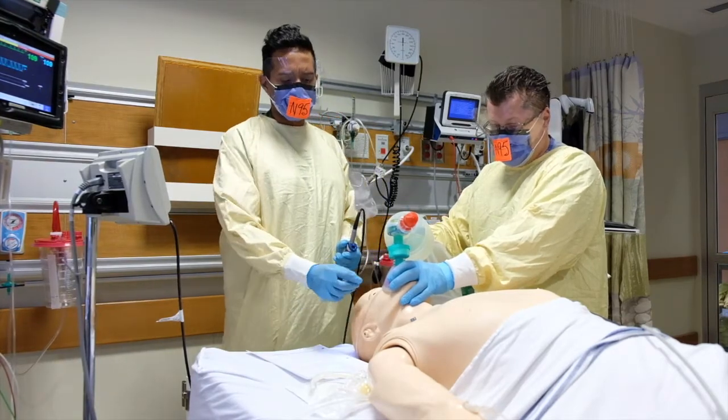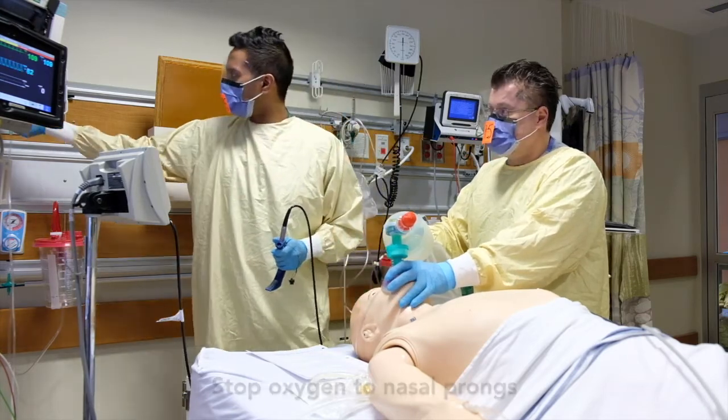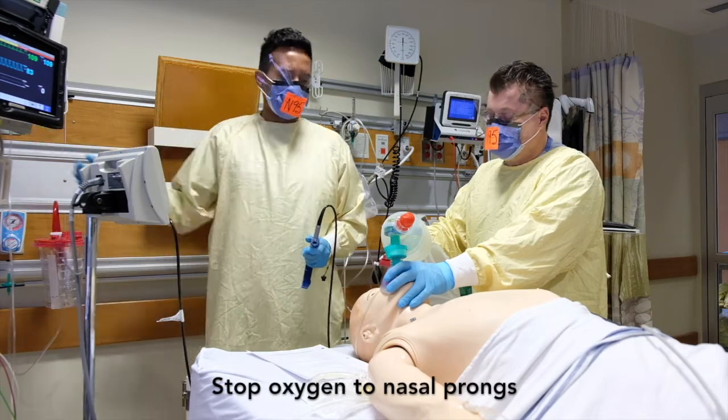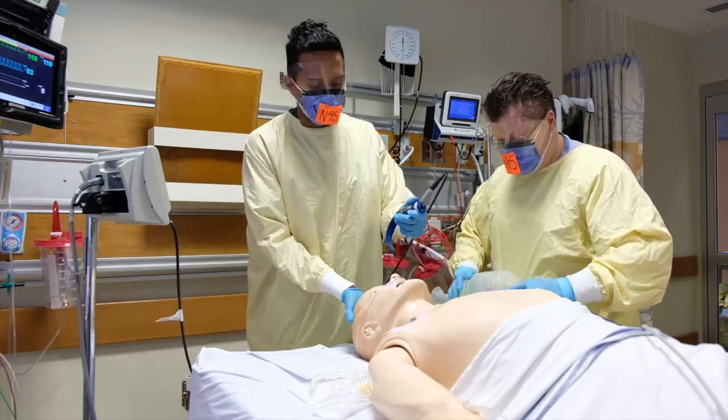The first thing we'll do, just so that we don't have pressure buildup underneath the mask, is we'll stop the oxygen nasal prongs. And after that, we'll take the bag valve mask off, and I will proceed with intubating.